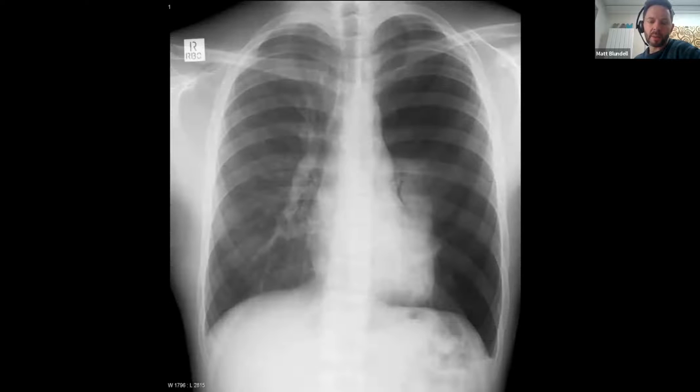So we'll start with pneumothorax. For example, we've got a 20-year-old male who's had a couple of days of sudden onset pleuritic chest pain while playing football. The reason he's come into the emergency department today is because he's just not getting any better and started feeling a bit short of breath. Examined him, SATs are okay, respiratory rate's okay, speaking full sentences, but this is his chest x-ray.